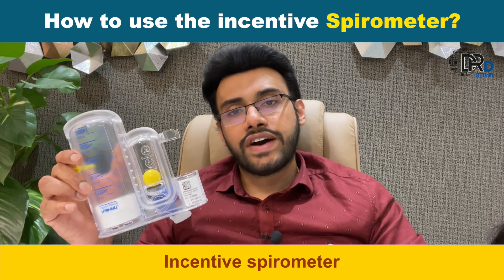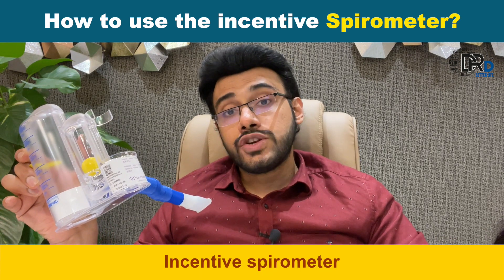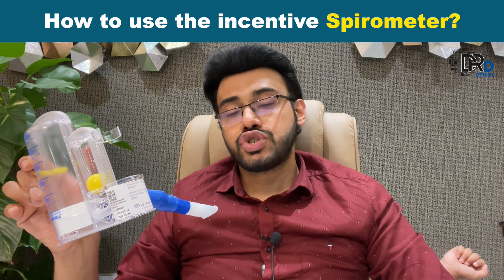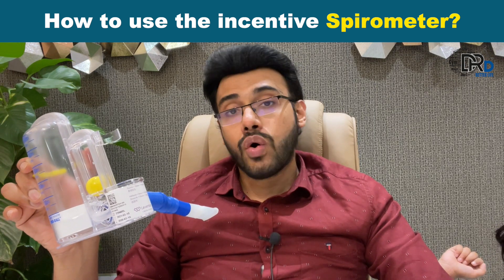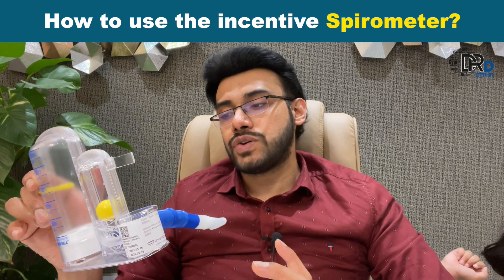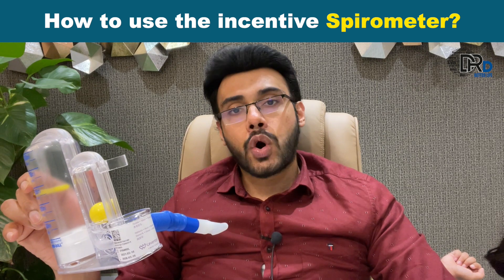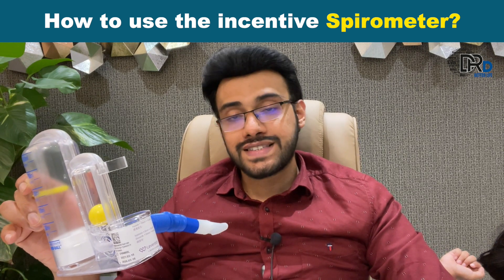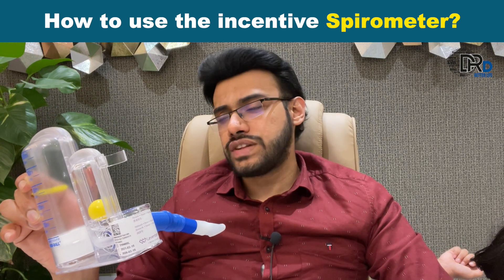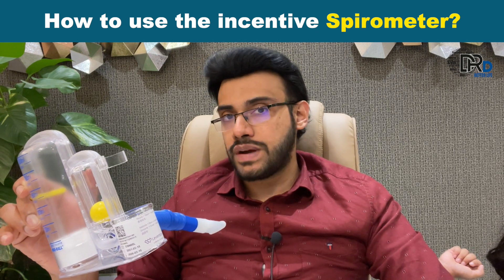One such method is the use of an incentive spirometer. An incentive spirometer is a device used to help our lungs to recover after surgery or a lung illness. The spirometer is also used in the case of chronic obstructive pulmonary disease, that is COPD. It is an inflammatory lung disease that blocks the airflow of the lung and makes it difficult to breathe, so it is very helpful for those patients.